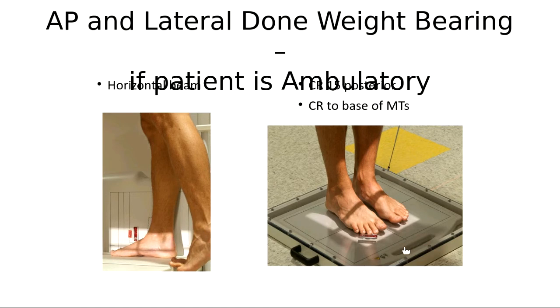Okay, so the patient's standing on that, and what these images will show is how the bones react under the pressure of bearing the patient's own weight. So the patient stands erect with their full weight evenly distributed on both feet, and this is angled 15 degrees posterior to midway between the base of the metatarsals. So if you were doing just one foot, you would normally center at the base of the third metatarsal. All you're really doing is bringing that central ray to the middle, kind of like when we did the ball catcher view, or the Norgard method for the hands. Okay, so that's the AP.